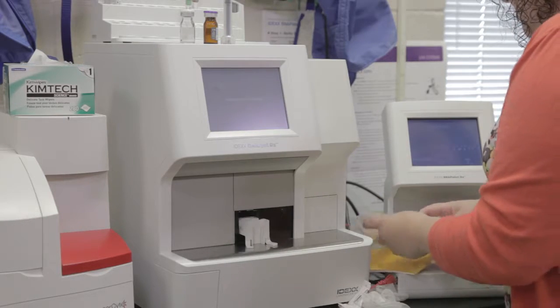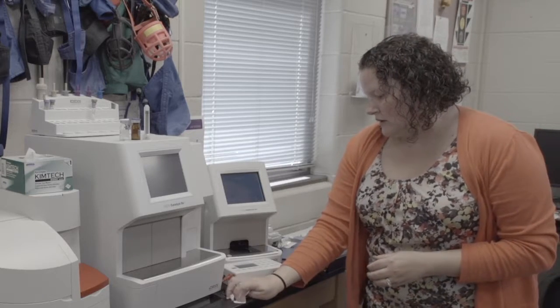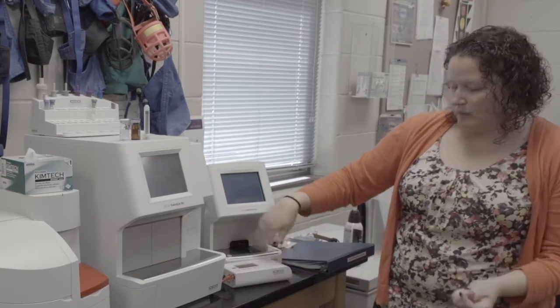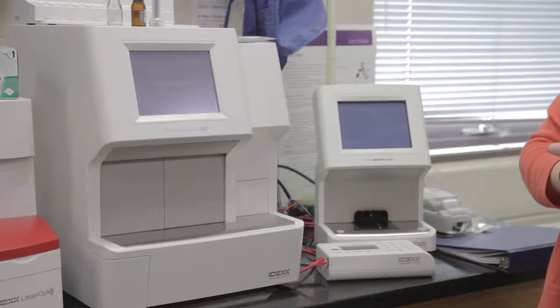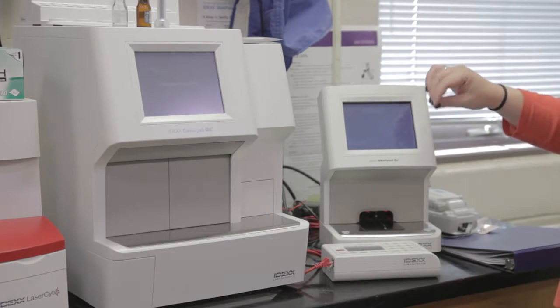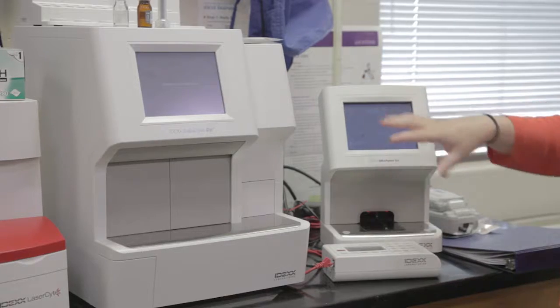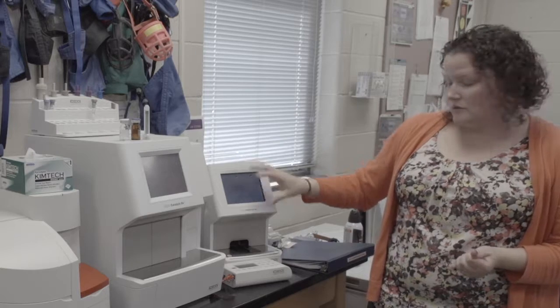Okay, so there is no maintenance requirement for the coag. There is no cleaning other than wipe it off, keep it clean. And as far as the snapshot, there is no cleaning requirement for that as well, other than wipe it off if it becomes dirty and just keep it generally in clean order. There is no quality control for this one either. And there's actually no quality control for the coag because it does a self-check every time you run a cartridge through it. So once this comes back up, then we'll go ahead and run our quality control.